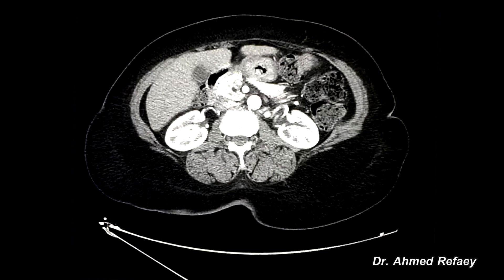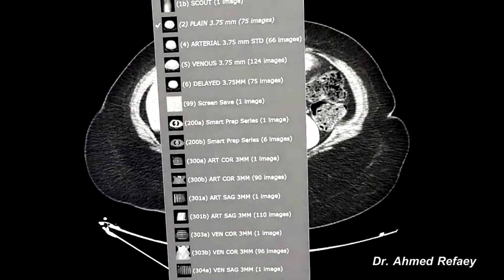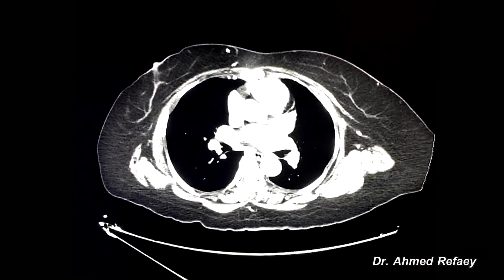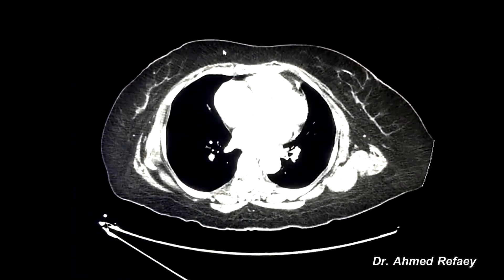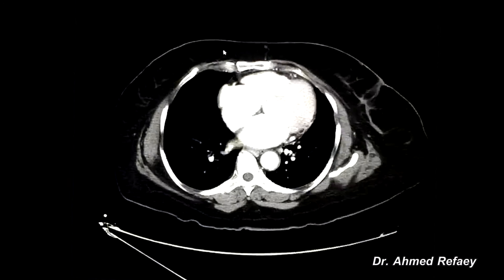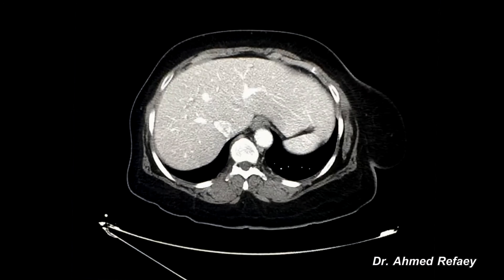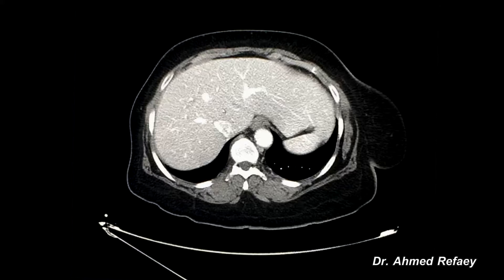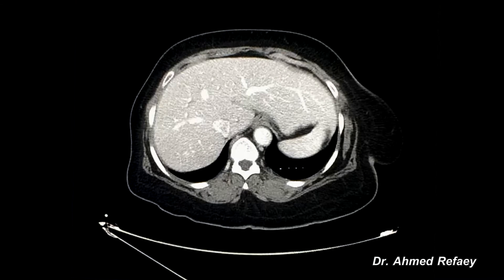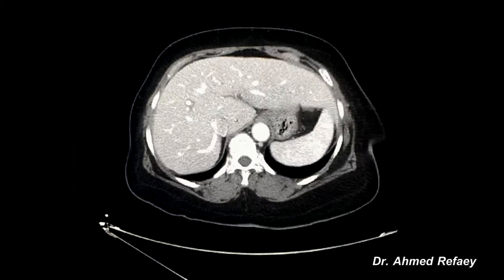The porto venous phase is imaging of the liver after approximately 70 seconds from the start of intravenous contrast administration, when the contrast reaches and enhances all the liver parenchyma. In this phase we can appreciate complete enhancement of the liver parenchyma, making it very easy to detect hypovascular tumors which appear as hypodense lesions.